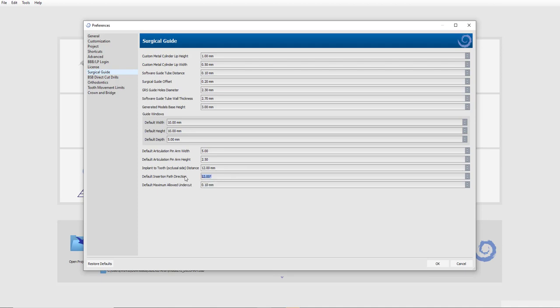Based on user feedback, 30 degrees was too much. In this release, we have updated the default path of insertion to 12 degrees. As I mentioned, in older previous releases, this was automatically set to zero. We didn't even have this field here, and we didn't allow the user to change it.